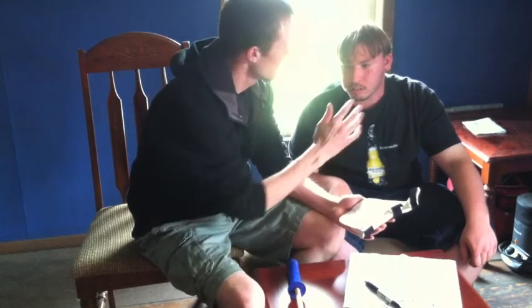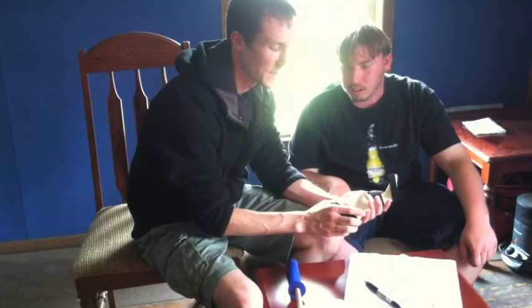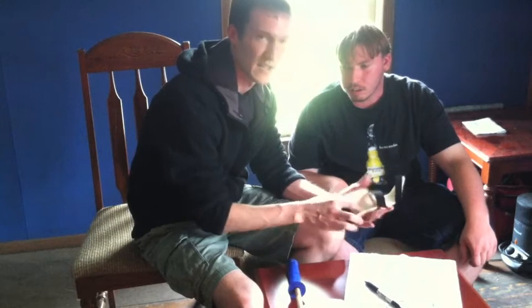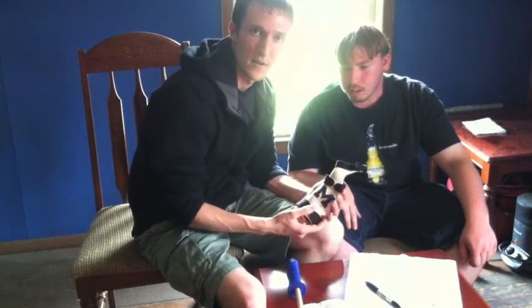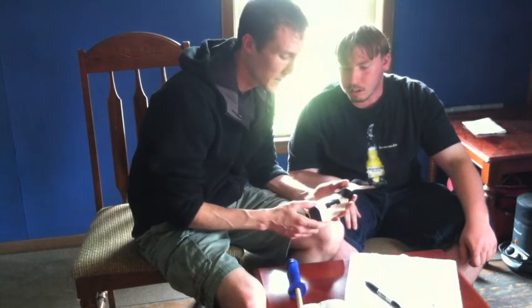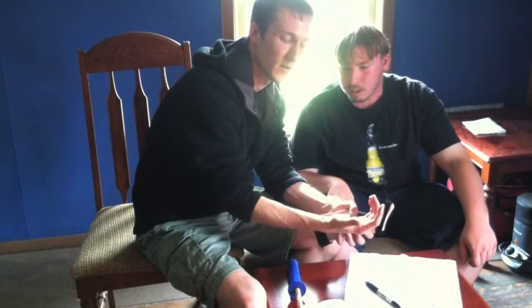And then what we do is we put it up to his hand, and we kind of mold it to his wrist and his hand here. So just to kind of create a custom splint. So this is just a basic standard wrist immobilization or cock-up splint, and really with a focus just to help neutralize the wrist and support that palmar arch here.